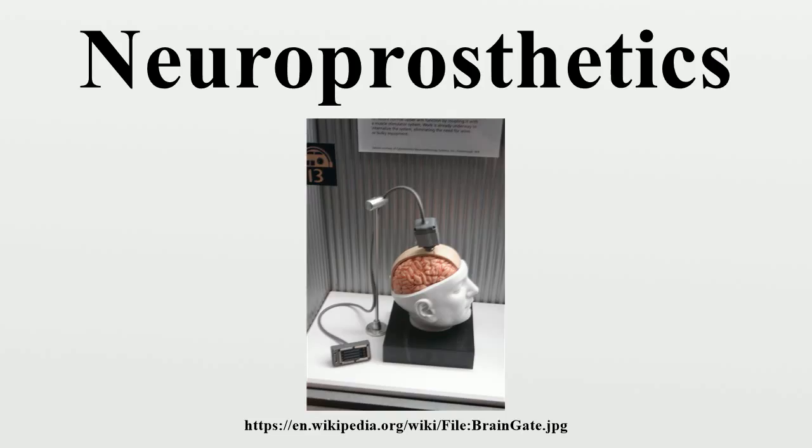Although clinical tests have proven most successful for retinal implants, a visual prosthesis system consists of an external imaging system which acquires and processes the video. Power and data will be transmitted to the implant wirelessly by the external unit. The implant uses the received power data to convert the digital data to an analog output which will be delivered to the nerve via micro-electrodes.